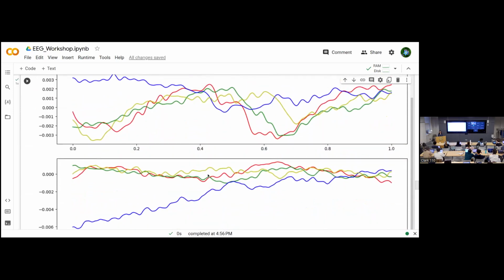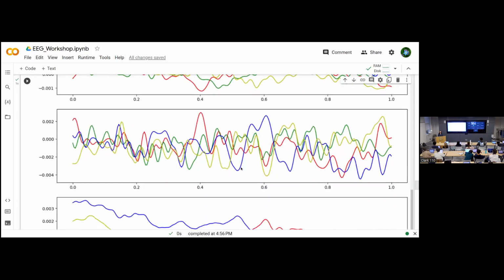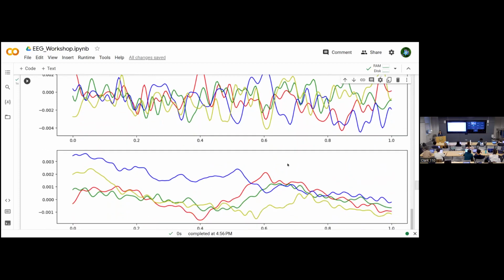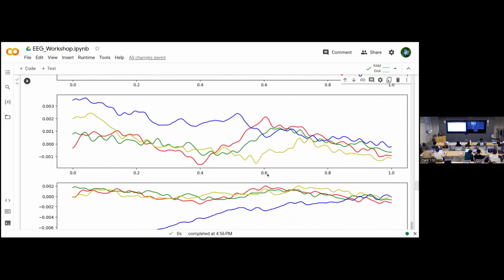Here it's pretty clear that the blue ERP, corresponding to a specific card out of the 4, is getting some pretty distinctive reactions to the cards. This channel is probably subject to a lot of noise. That happens pretty frequently with these EEG devices, so they can get unreliable.